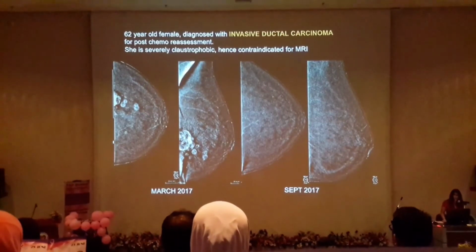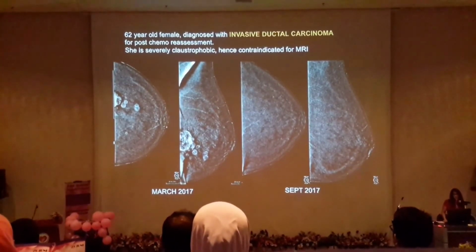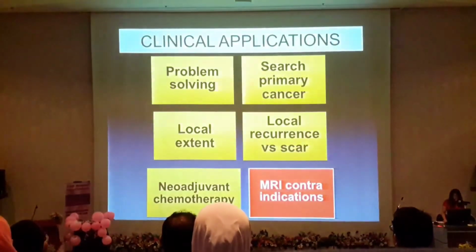We were a bit scared. We were wondering whether the contrast actually went into the breast. We did an ultrasound, and there were no lesions seen in the subsequent images. So she actually had a very good response to treatment.